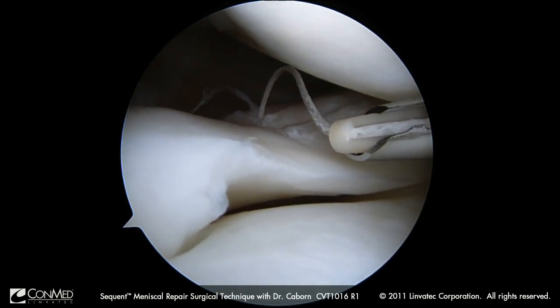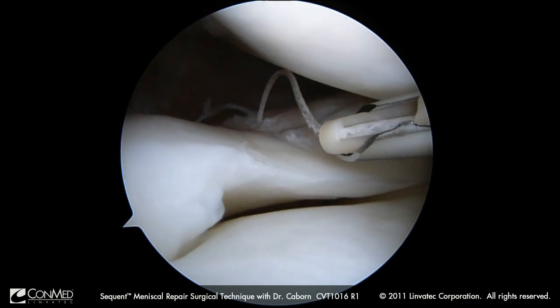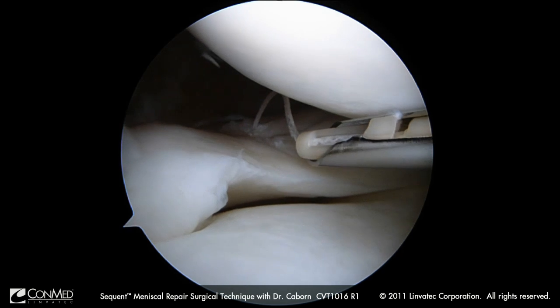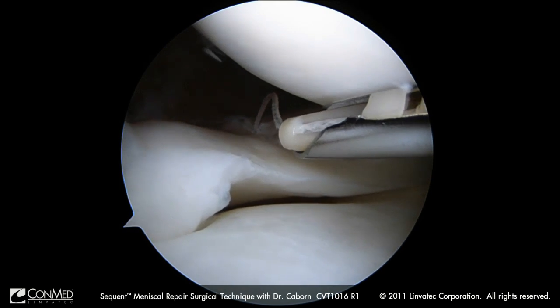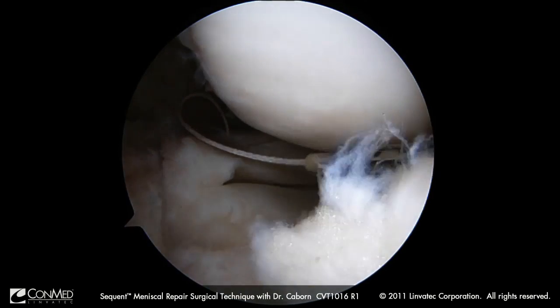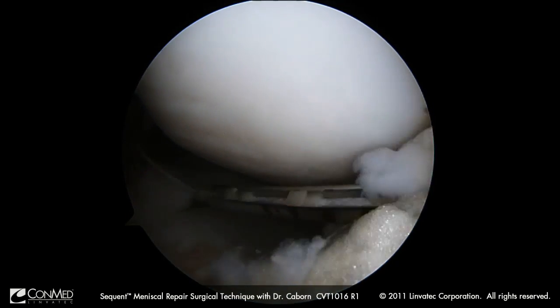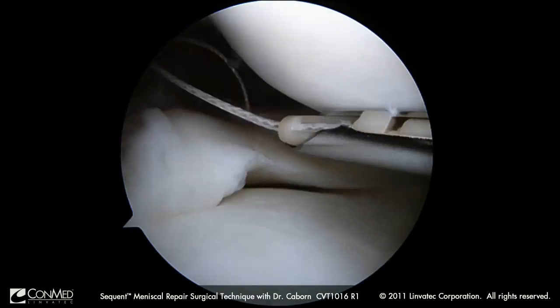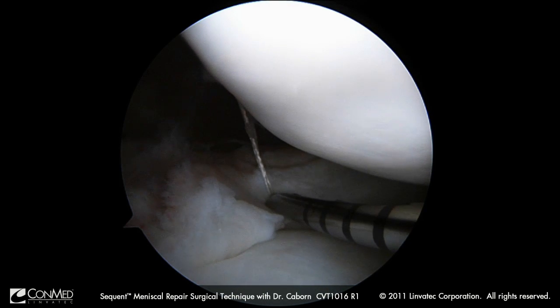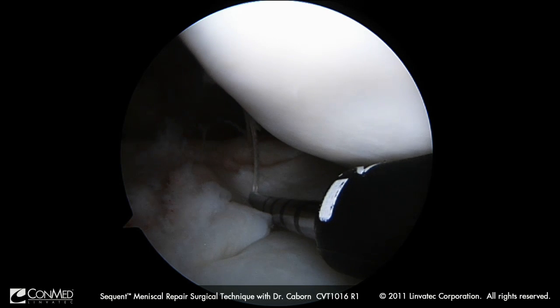We can see our suture has been placed with the implant now sitting on the back of the meniscal-capsular junction. What I want to do here is come back, make sure I have slack in the system, until I come pretty close to the edge here — so a nice loop. I would like my first stitch to be close to a vertical stitch.